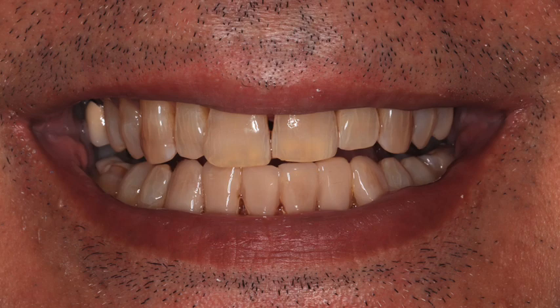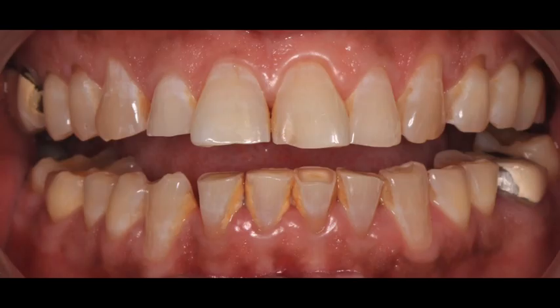It's not too bad. Of course, the most difficult part here is the interdental cleaning of the composites, and that takes most of your time. Each tooth takes around 20 to 25 minutes. So you give a long appointment to the patient, and that's the way forward.